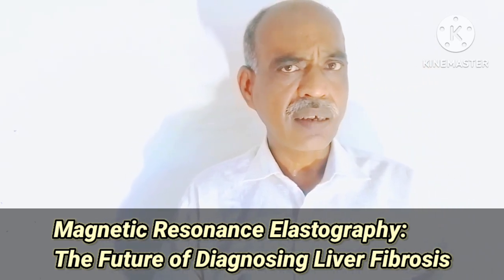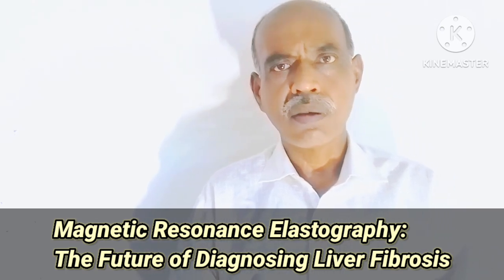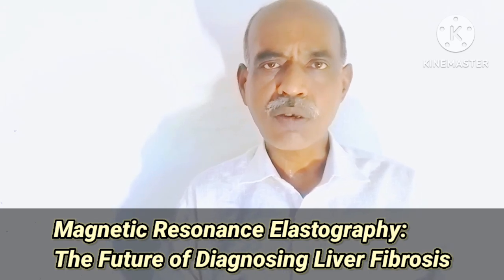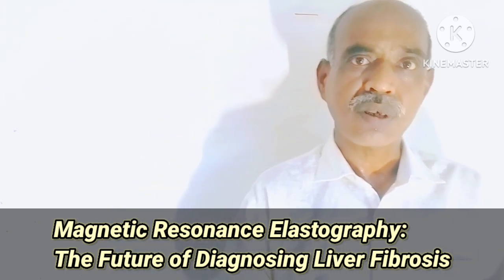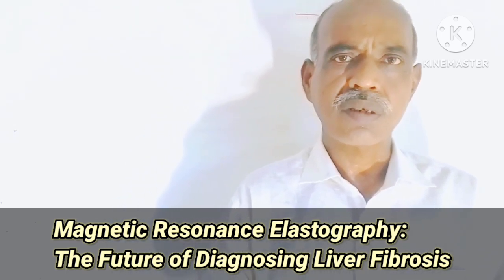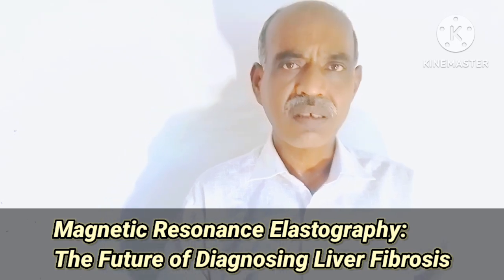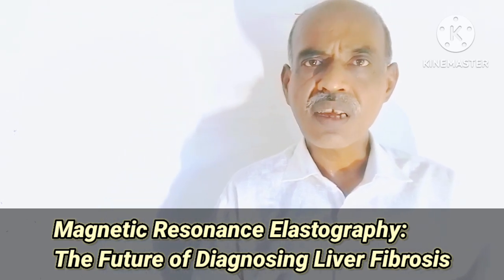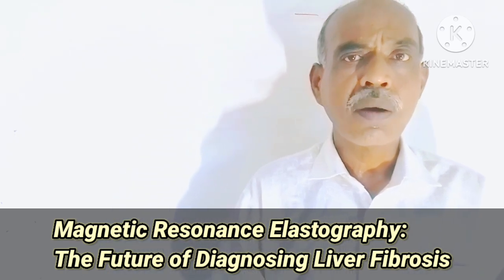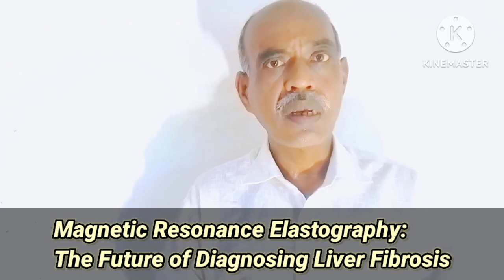And one more thing is that sound waves cannot produce images with very high resolution. But here in this case, high resolution images are required. So that means the sound waves alone cannot produce the desired result. What is the desired result here in this case? Desired result is to know the perfect location of stiffness of the liver tissues.